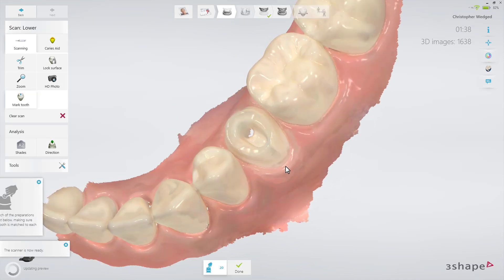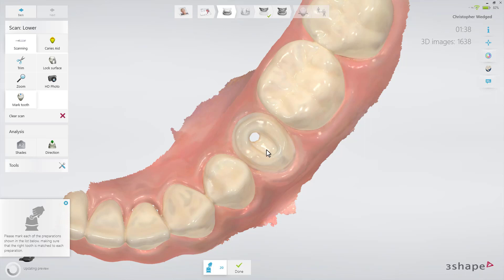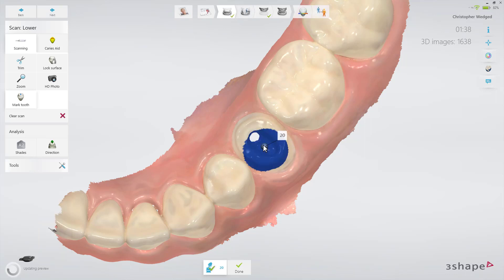Finally, mark the preparation. You'll see a blue overlay around the preparation mark, indicating the area that will be automatically cut out when going to the scan post page. If necessary, you may reposition the preparation mark to obtain your desired cutout.